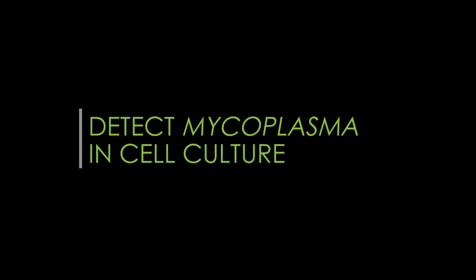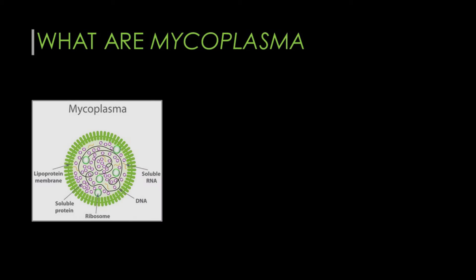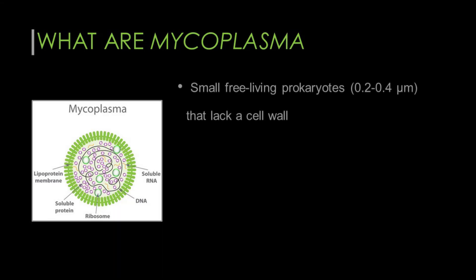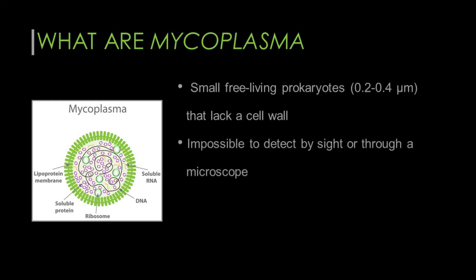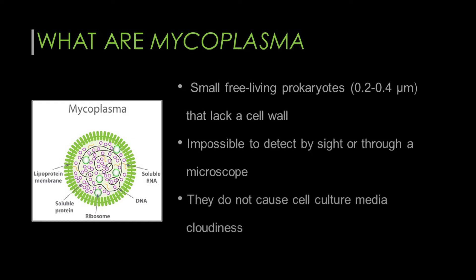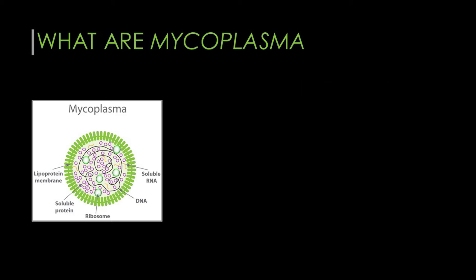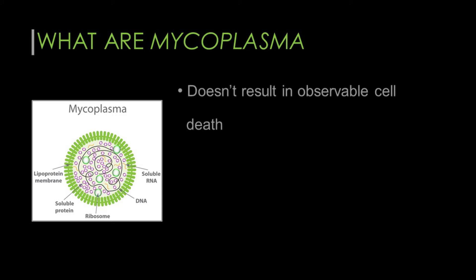Mycoplasma is a group of bacteria that commonly contaminates cell cultures, such as human cells and other mammalian cells. They are very small, free-living prokaryotes that lack a cell wall, making it impossible to detect them with the naked eye or even through a microscope. In addition, they do not cause cloudiness, which often accompanies other types of cell culture contamination. Most importantly, mycoplasma infection generally does not result in observable cell death. Consequently, they can proliferate and go undetected in cell culture dishes for a very long period of time, becoming a major obstacle to performing reliable and accurate in vitro experiments.